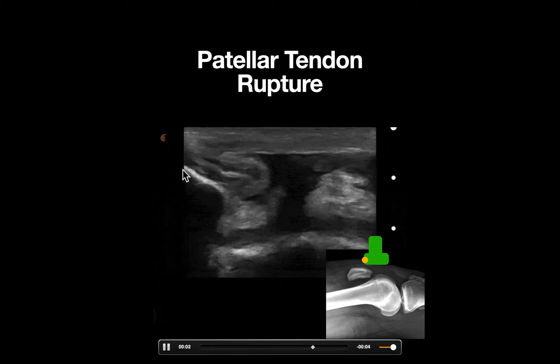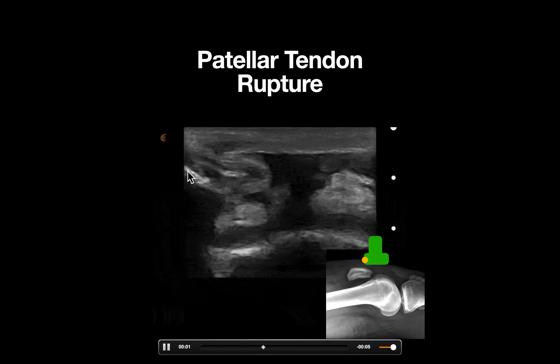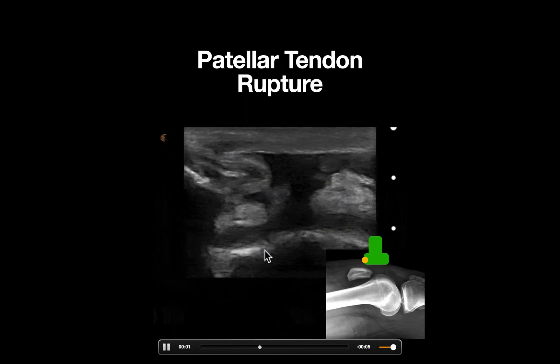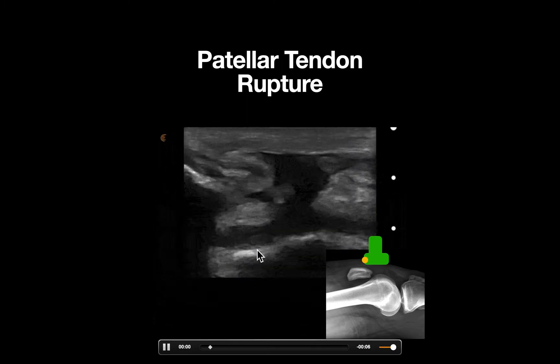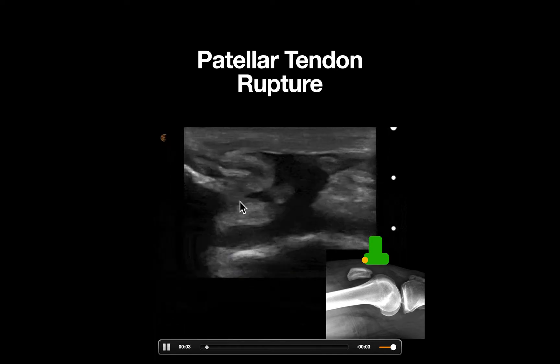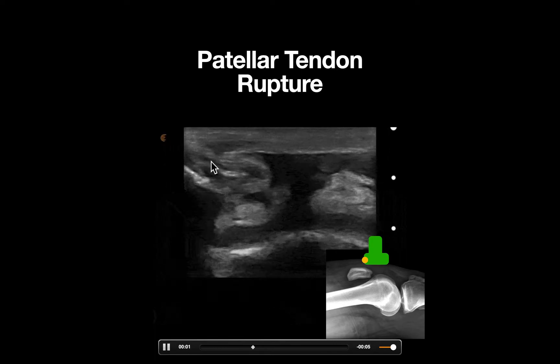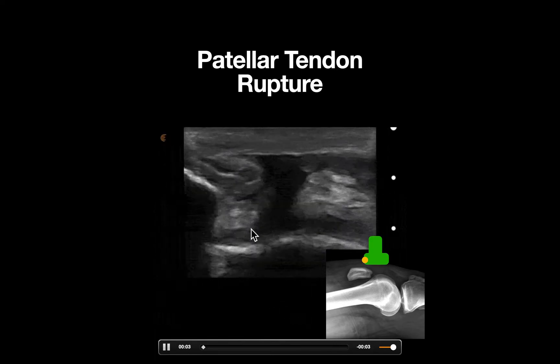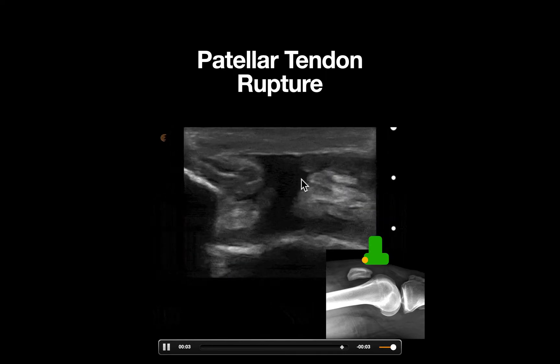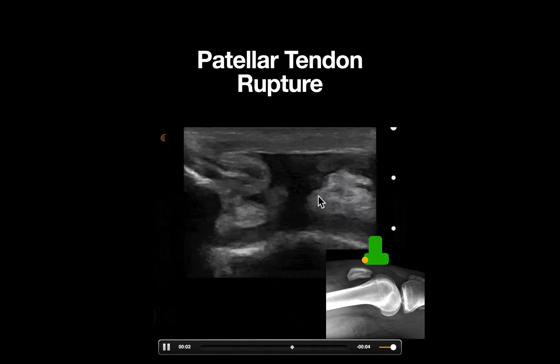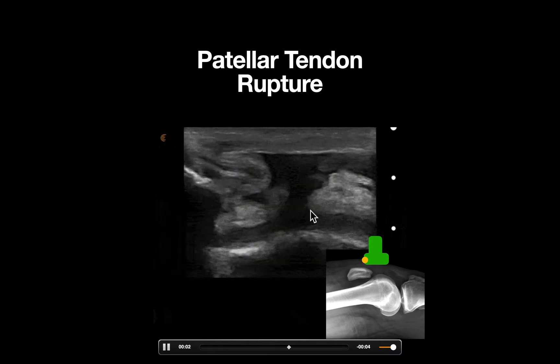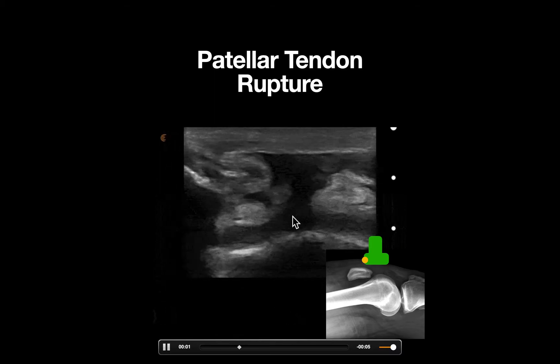In this clip, we can appreciate the patella as a hyperechoic line with associated shadowing, and our distal femur can be seen here. Notice just above this we can see our patellar tendon. We can see a piece of the tendon here, as well as a separation by anechoic fluid, and the opposite piece of the tendon here. This is consistent with a full thickness patellar tendon rupture.